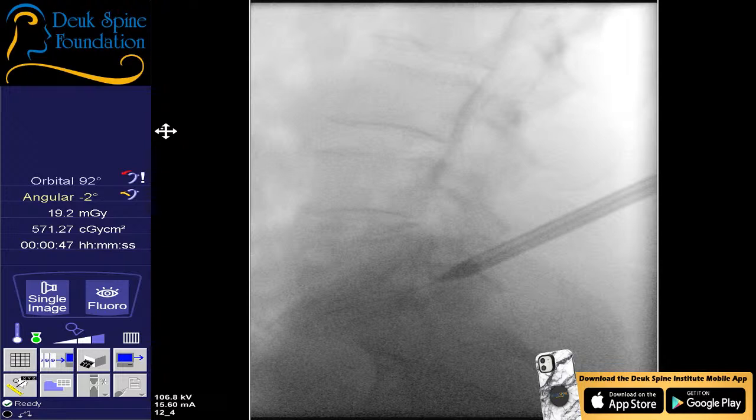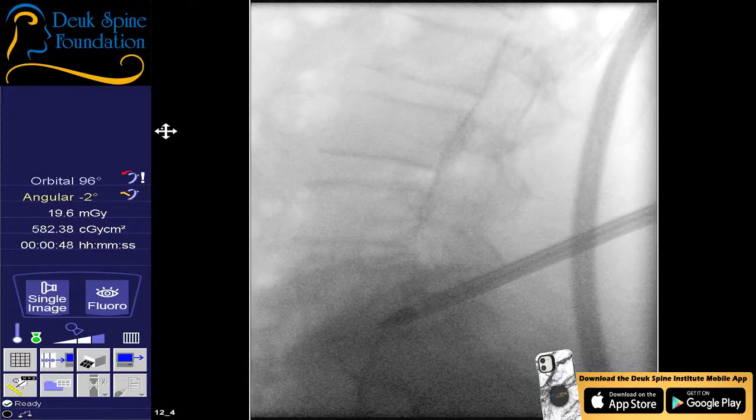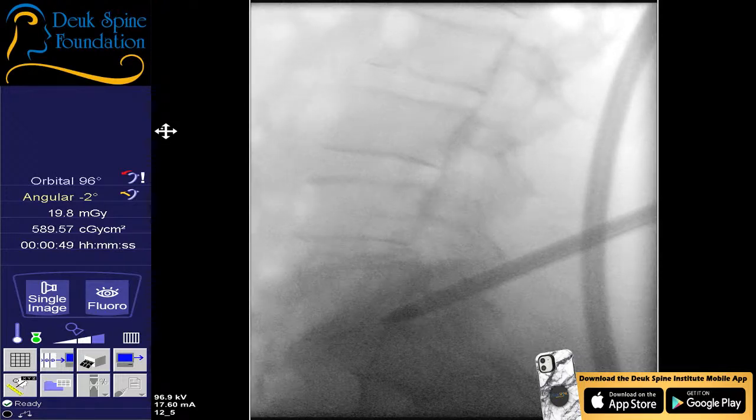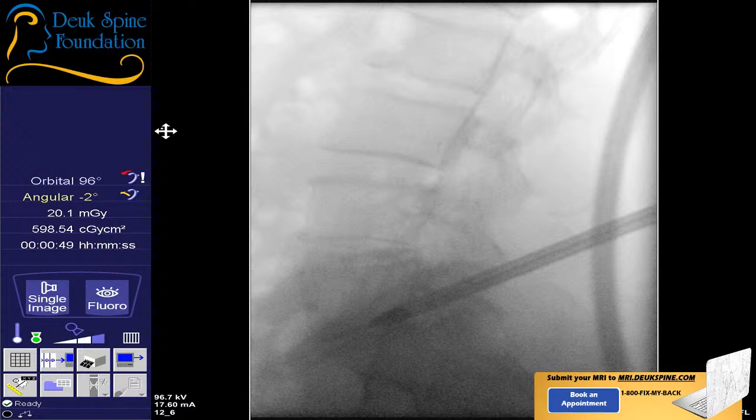Just lay still, you're doing great. Shot. You're doing fine, everything's okay. You see how your pedicles are superimposed with a wag? But they're not. You've got to bring your side down. That's what I told you before. Shot. Let's try that. You're doing fine. Everything's okay. Yeah, I think that's better. Why am I not seeing the guide wire? Shot. All right, there it is. You're doing okay. Just lay still. You're doing good. Shot.